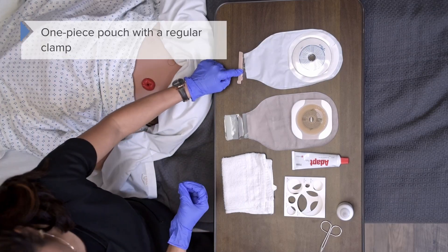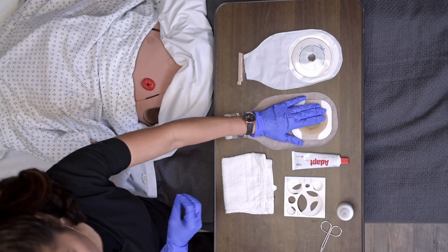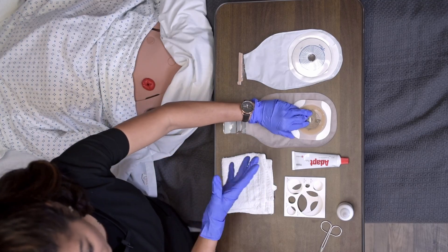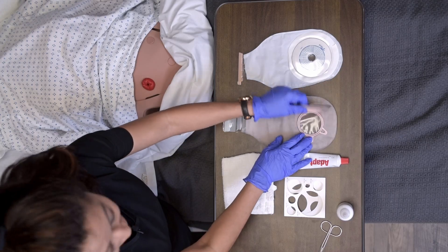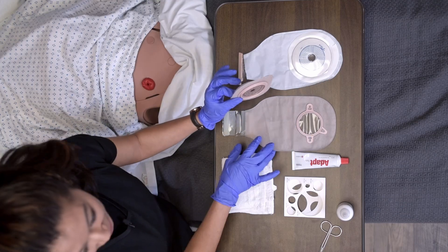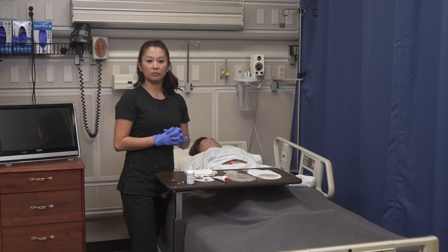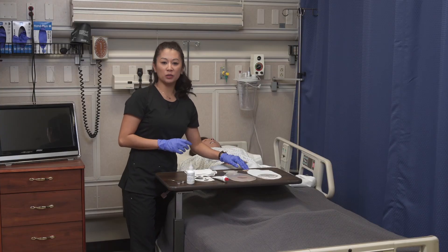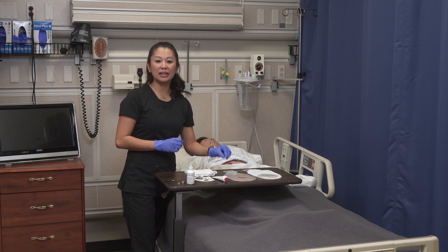Now the two-piece system: the nice thing here is you've got the wafer — which is what we call this part — and then you've got the pouch itself. You can see how this is two pieces and this adheres to here. On our one-piece we have a traditional clamp, while on our two-piece we have a different type of closure. Let me show you how that works.